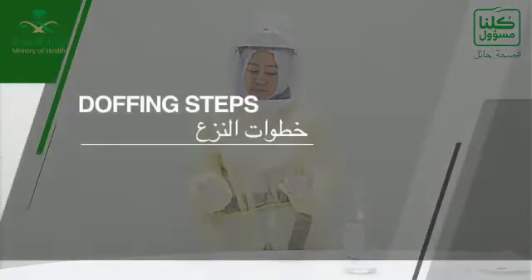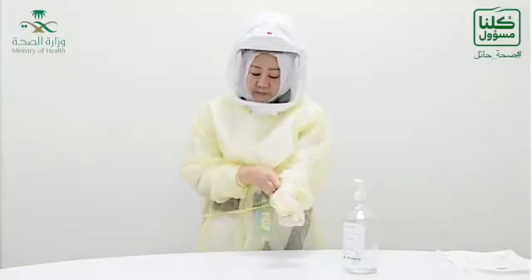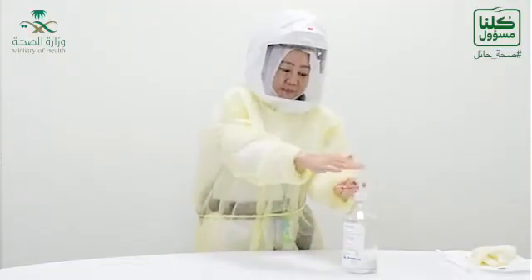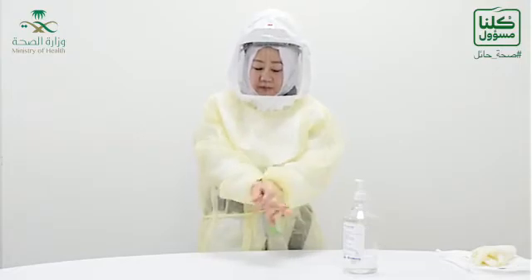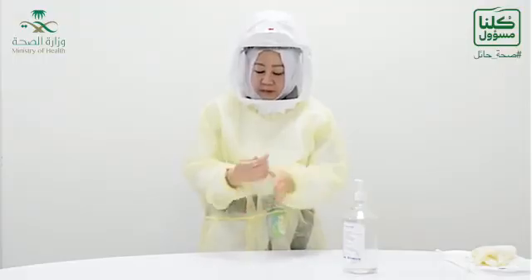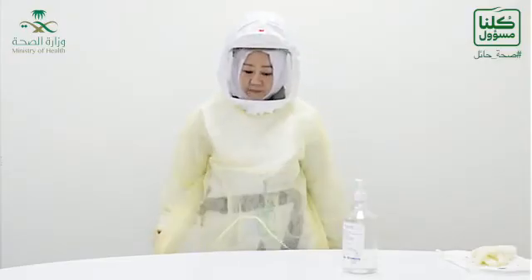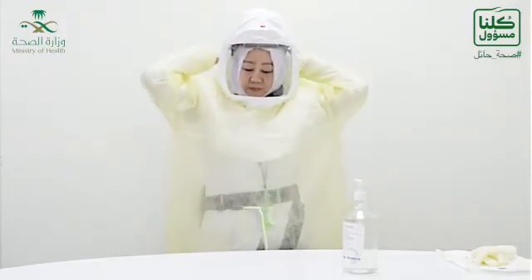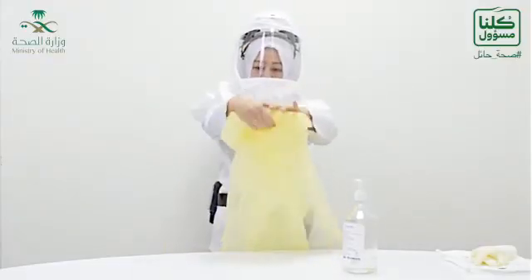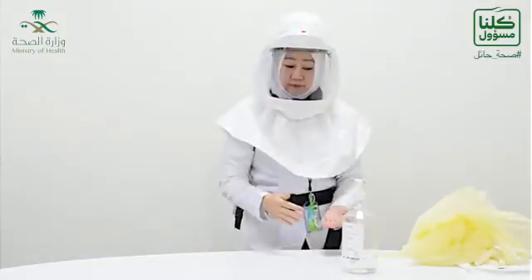Now we are going to talk about how to doff. The first thing to take off is the gloves, then perform hand hygiene. Again. Then doff the gown. All gloves and gowns have to be discarded in the yellow-coded bags. Hand hygiene.